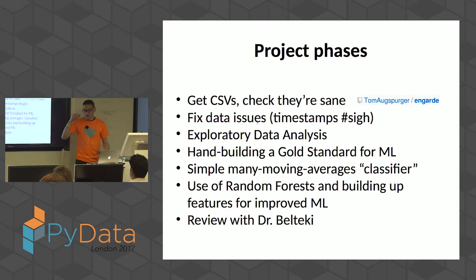One of the first questions is always, is my data sane? Does this data represent what I think the machine is telling me? And one of the questions is, well, the machine is giving me timestamped data. Of course, every timestamp is going to be unique and incrementing. Because of course you wouldn't have time series data going backwards in time or being repeated. It turns out that the timestamps are an issue. And if ever you've heard me talk before, you know that I always go on about gosh darn timestamps because they're always broken. Time data is always broken in our fresh data sets that come in.